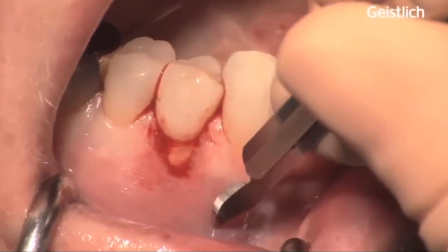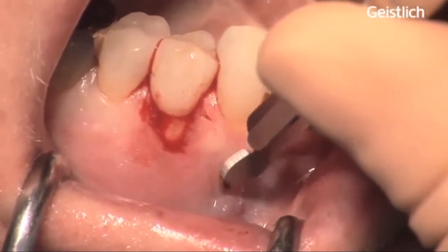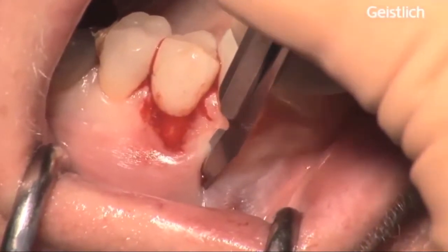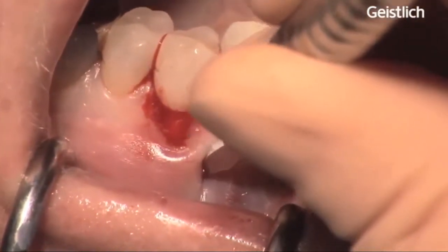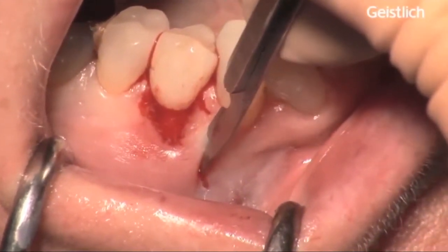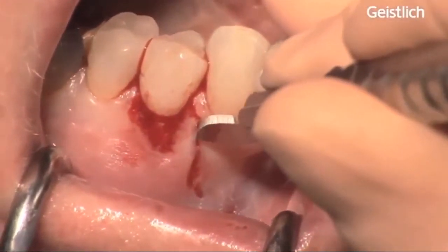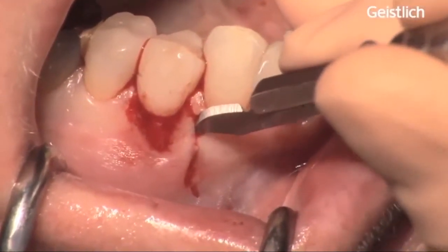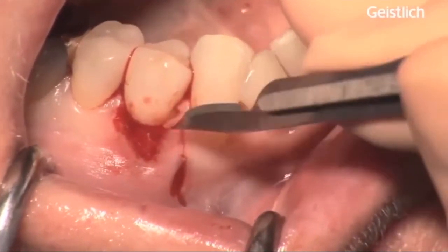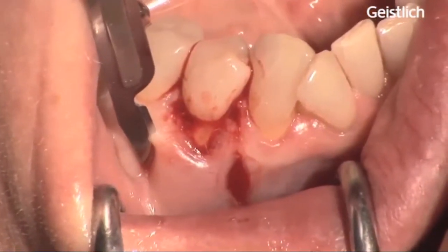Two vertical divergent bevel incisions are performed at the mesial and distal line angles of the adjacent teeth. The blade is kept almost parallel to the bony plane, leaving a very small band of periosteum to protect the underlying bone and leaving soft tissues mesial and distal in the recipient bed for better healing of the overlying flap when coronally positioned.